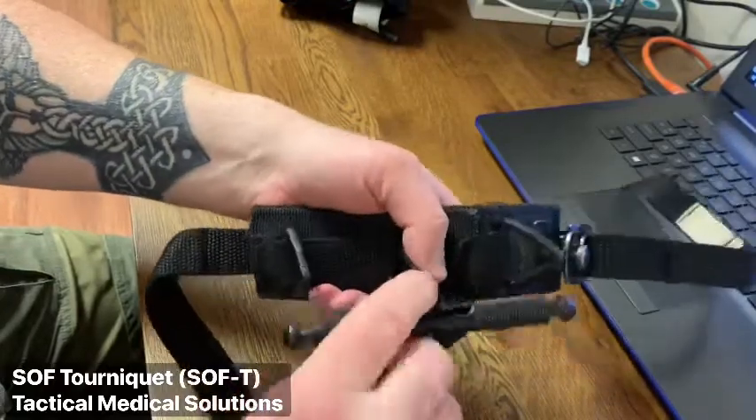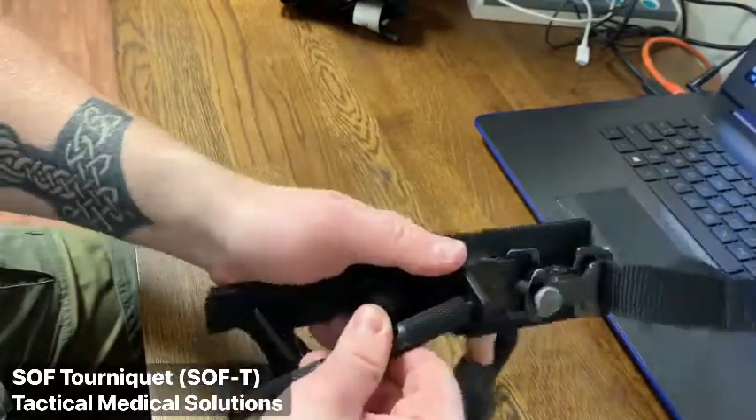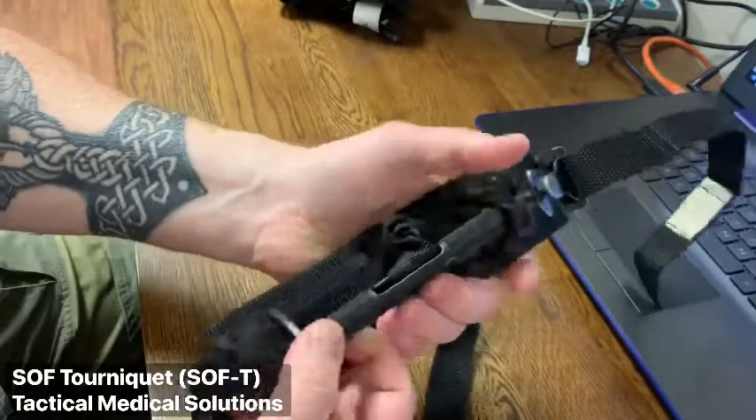The windlass rod is made of a lightweight metal construction. Once you rotate the windlass enough until the bleeding is stopped, you can secure the windlass within the two triangular plastic clips.